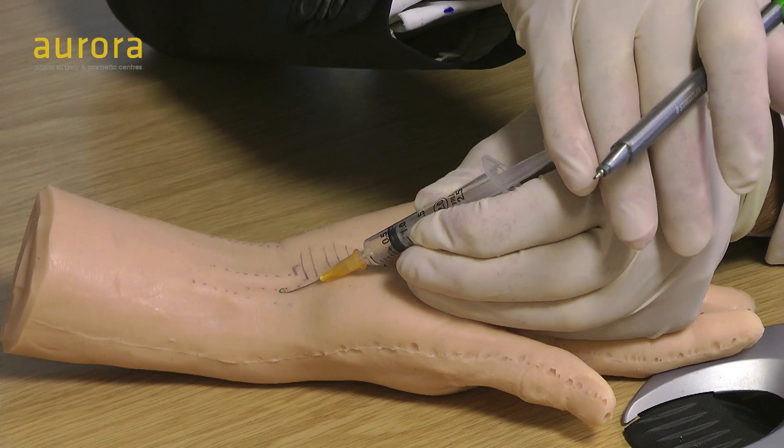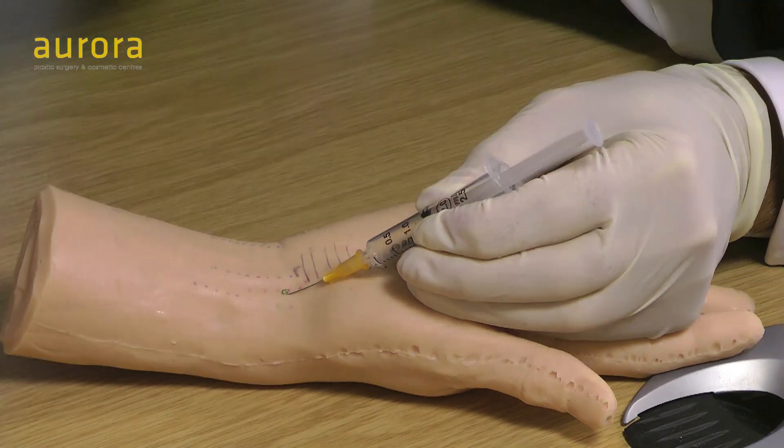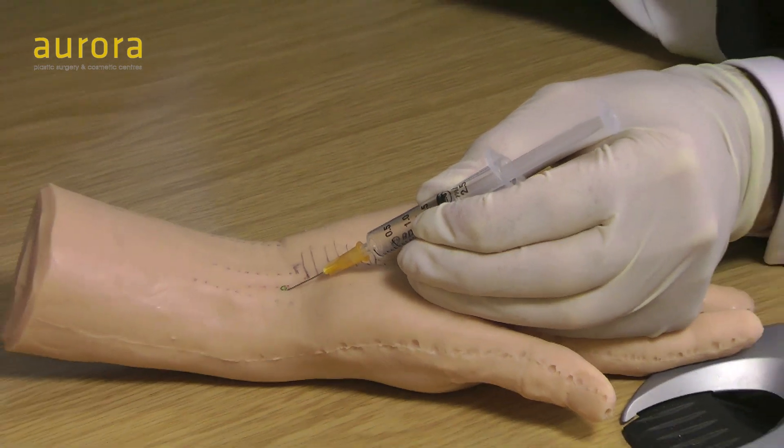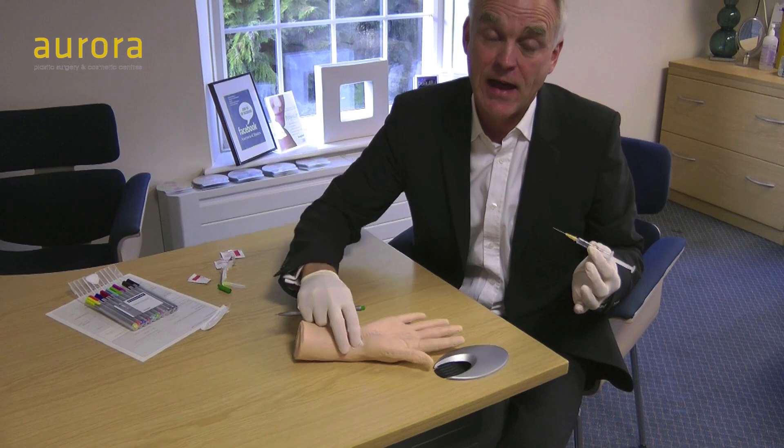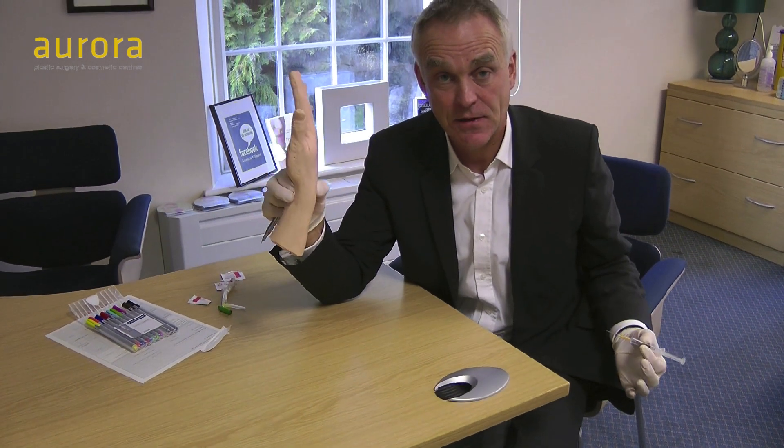It should go in really easily — though it won't in this hand because it's a false one. Then withdraw, apply pressure, and elevate the hand — with any hand procedure, elevating the hand reduces bruising and swelling. Wait a couple of minutes, talk to the patient, and ask them to move their fingers to disperse the local anaesthetic up and down the carpal tunnel, and that's it.